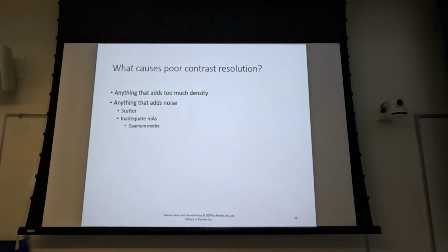People shot thin anatomy with as high kVp and as low mAs as they could get, and could not introduce quantum mottle on the image. So our image receptors have gotten so sensitive that we still have to teach this because it's still on the registry, but it just might not even be a thing anymore, right?